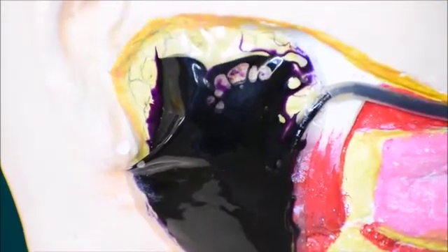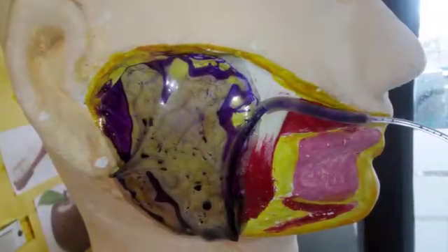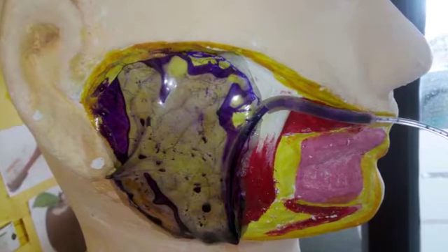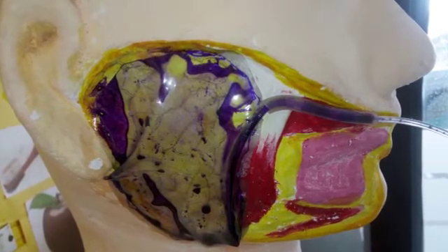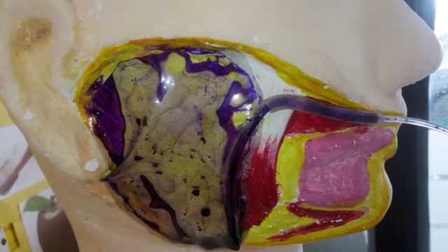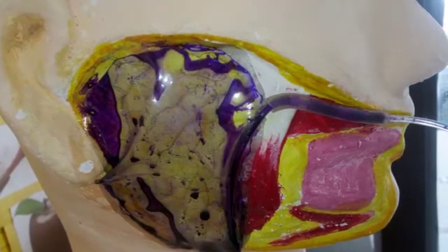The third phase is the emptying phase. After the final sialographic views have been made, the cannula is removed. The patient is asked to chew gum or a lemon slice and then rinse. After 5 minutes, radiographs should be made. These provide information about the excretory function of the gland. A normal salivary gland excretes out the dye within 5 minutes.